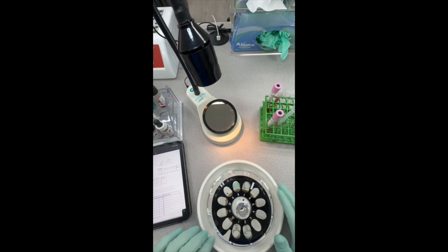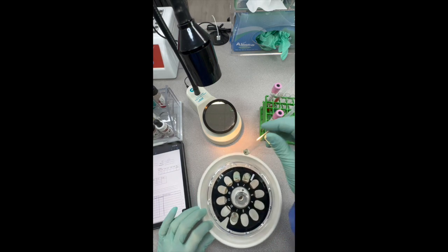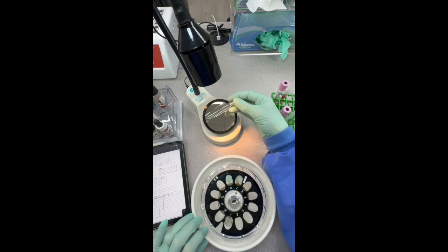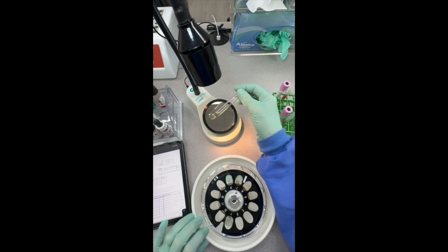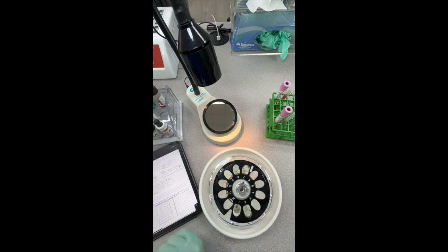Okay, we have our tubes out of the centrifuge. We added our AHG. We're going to go ahead and read our D for our patient H. And if we shake that, you can see, oh, we have some nice clumps now. So this tube, our D tube, was negative at both the other phases, immediate spin and 37. With the AHG, we now have clumps. So this is now a positive reaction that we're going to record over here on our sheet. So at AHG, I'd probably go with a 2+ on that one.